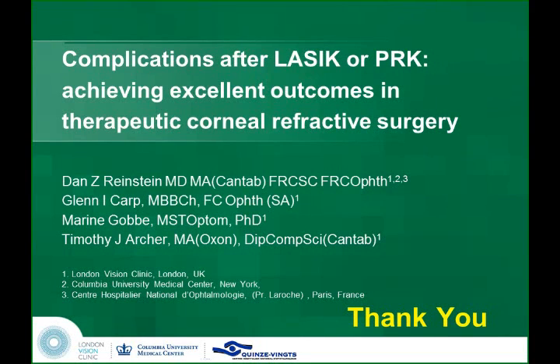Yeah, just a quick thing. I've never done this before, just an idea. Is it possible to remove the epithelium and then do... That's probably topography. Yeah, Pablo Michigera does that. You can remove the epithelium and then do a topography and then do a topography-guided treatment. However, as you can imagine, there are quite a few errors that could potentially be introduced by hydration, dehydration, differential hydration, and the stromal surfaces can often be very irregular. So, when you put the drop of something on the cornea to get a topography, you're now masking the irregularity again.